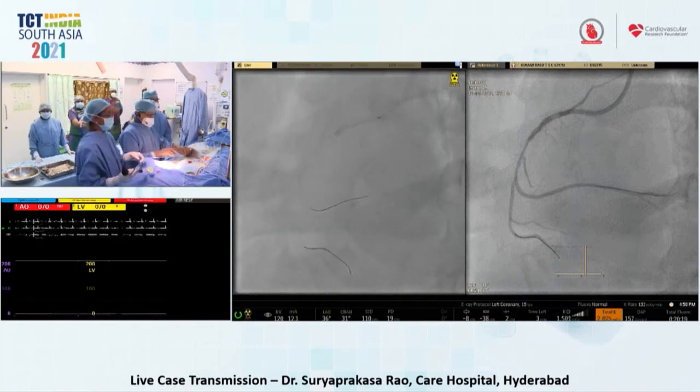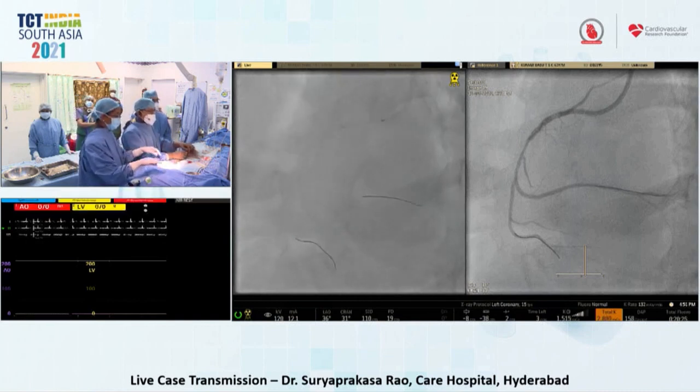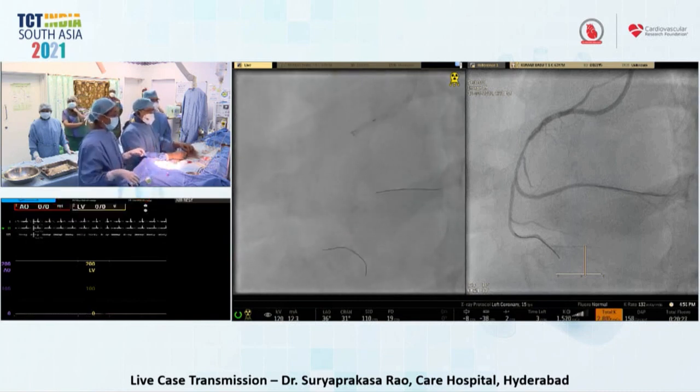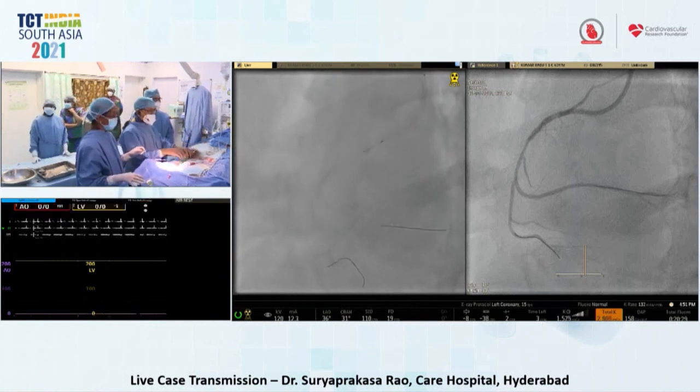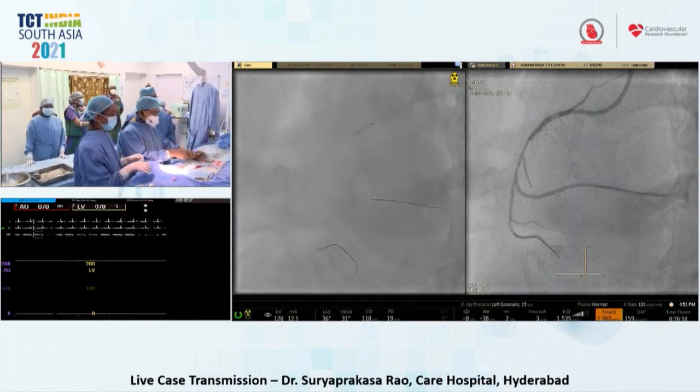Yes. Wire. Yes. Yes. We want to do high pressure dilatation.